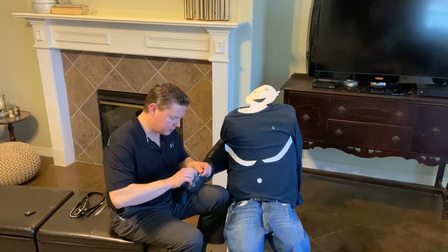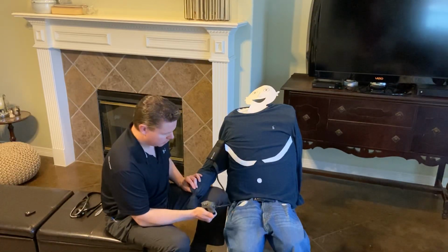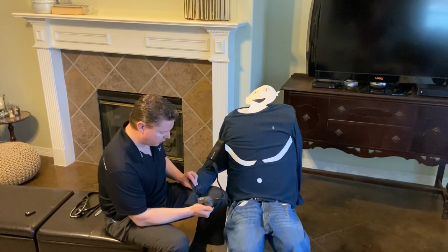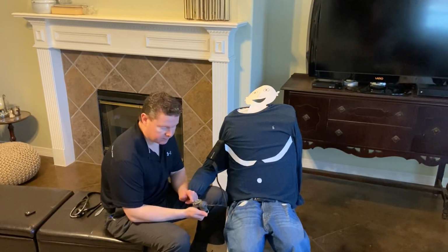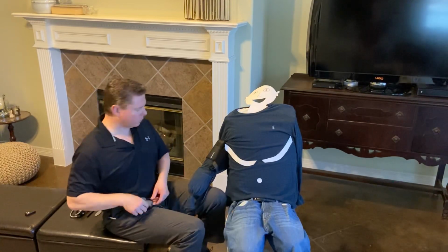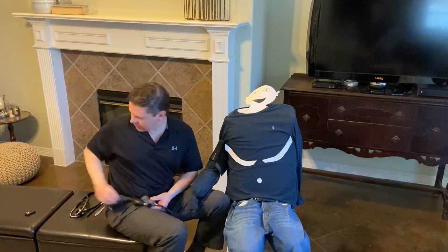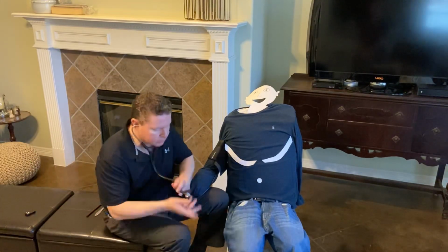We're going to estimate the systolic pressure through palpation. Find the radial pulse, and I'm going to increase pressure until this pulse obliterates. When I no longer feel the pulse, I'm going to take my reading, and that is the estimated systolic pressure. To that pressure, I'm going to add 30 millimeters of mercury, and that's what I'm going to pump the cuff up to as I take blood pressure.